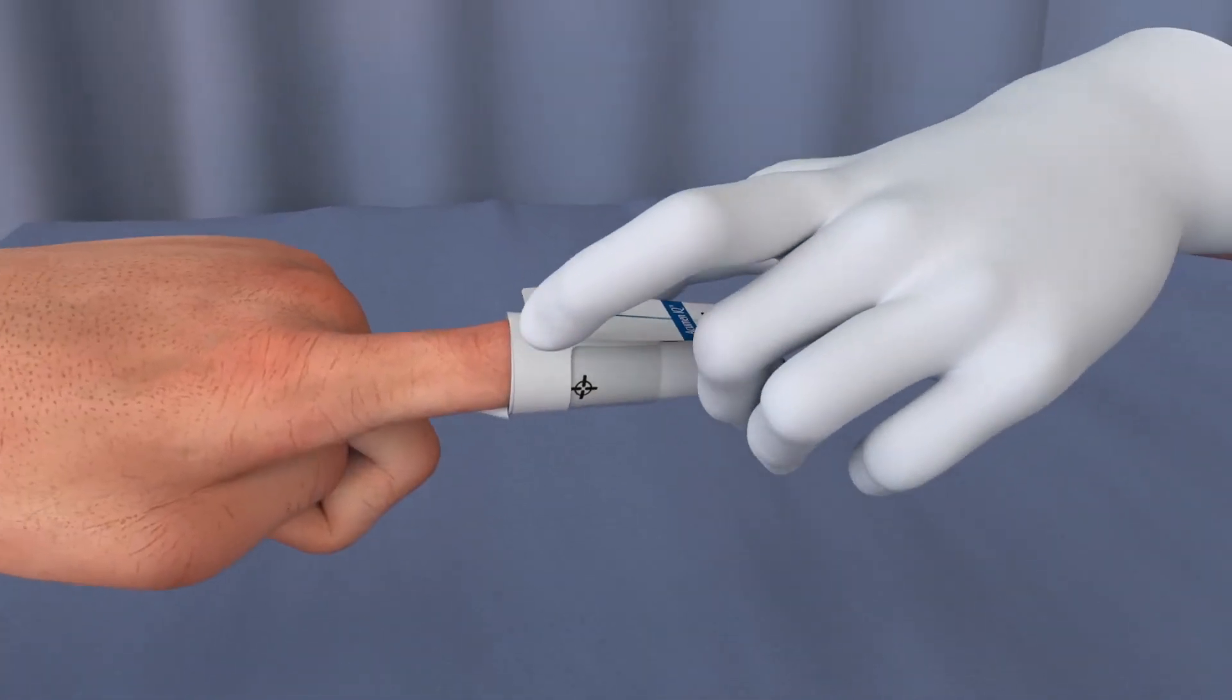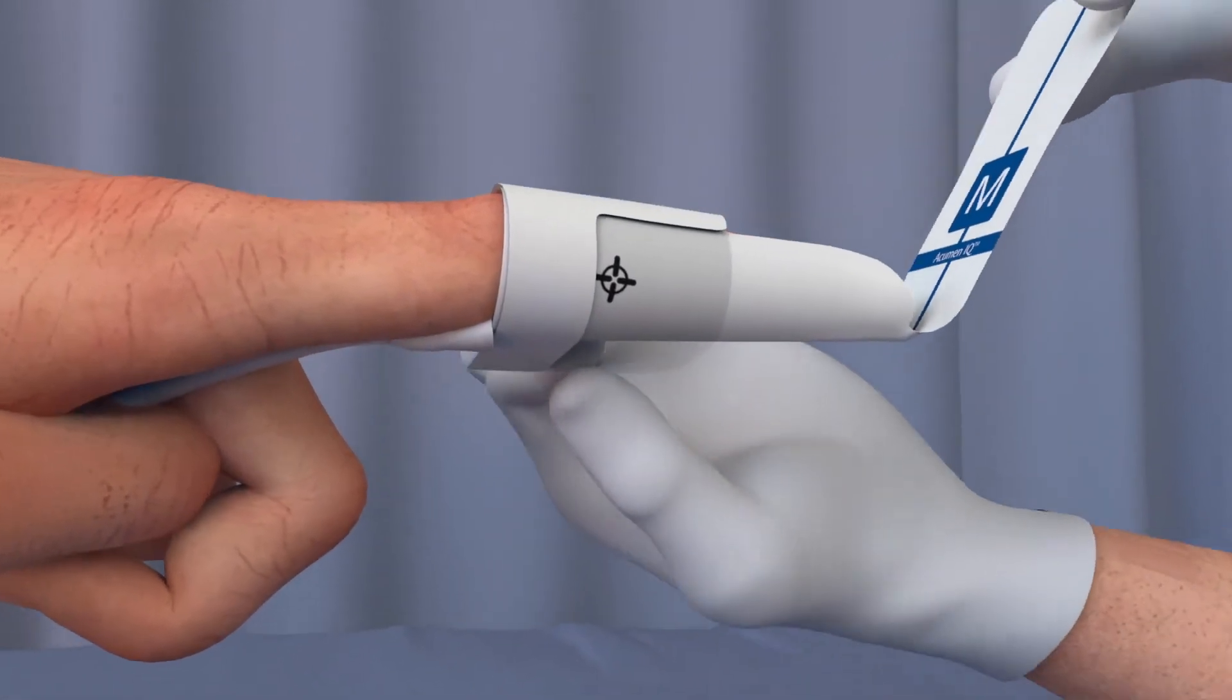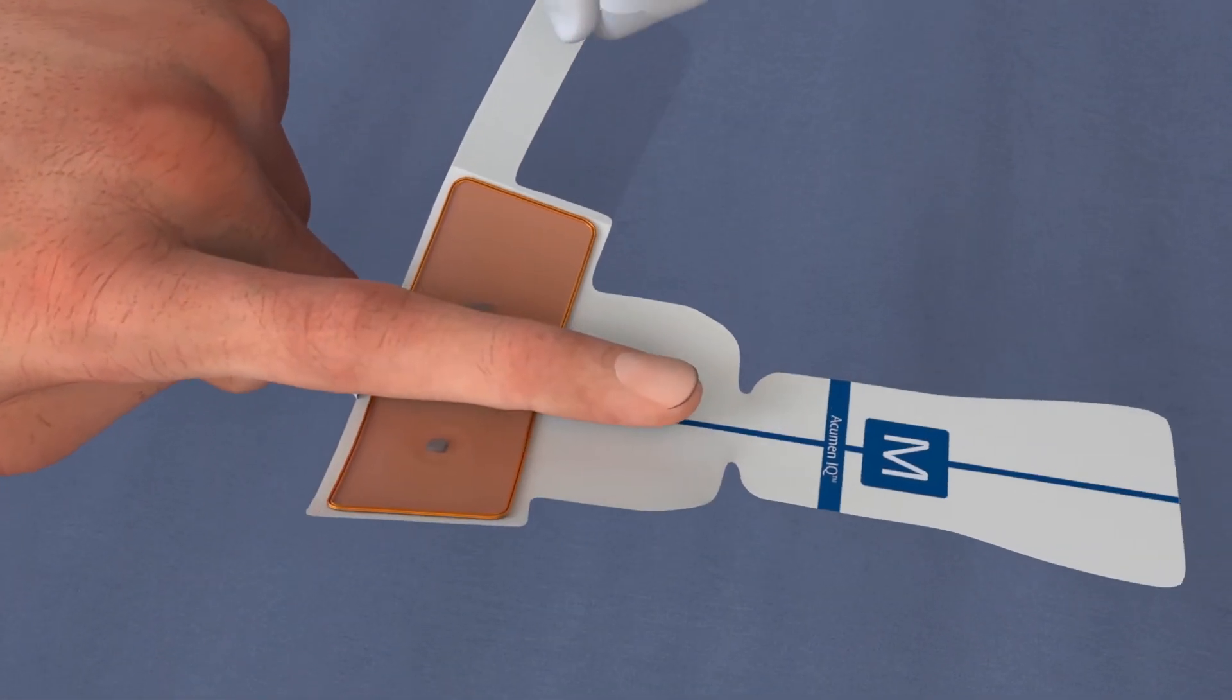To remove the cuff, pull on the end of the tab that is not adhered to the cuff. Ensure not to pull on the white tab.